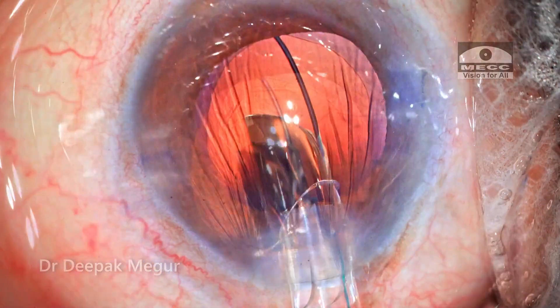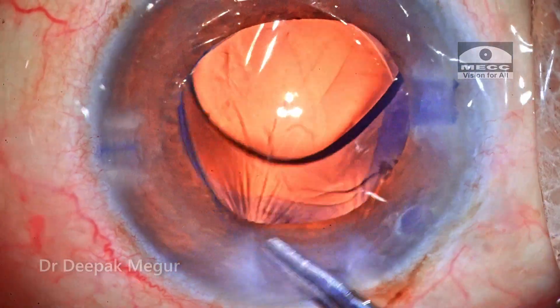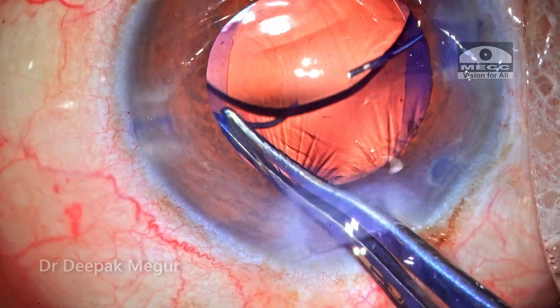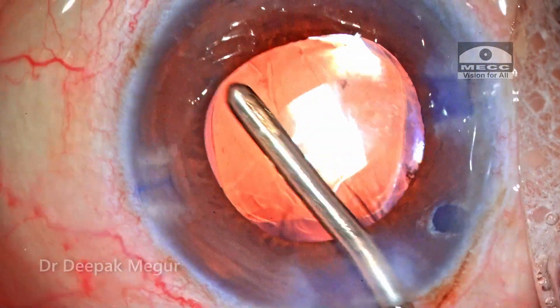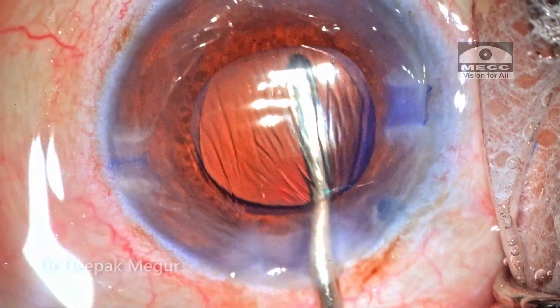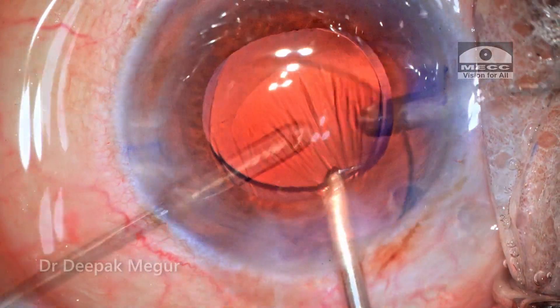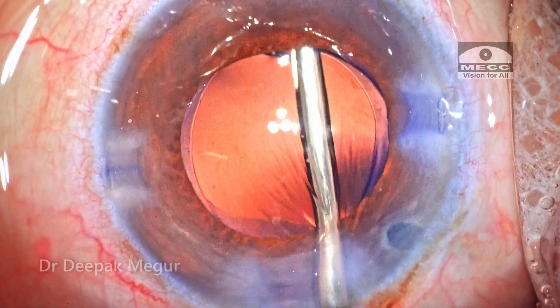A multi-piece hydrophobic lens is being placed into the bag. I usually use the IOL trap technique in eyes with much more pronounced zonular weakness, but in this situation the zonular weakness was mild, so I'm using in-the-bag fixation of the lens. OVD both in front and behind the lens is aspirated out, and that's it — the case is done.